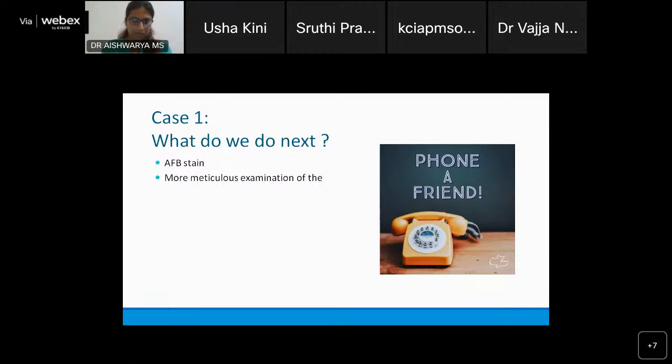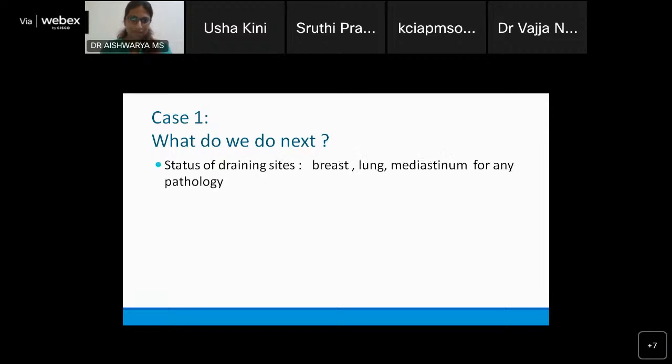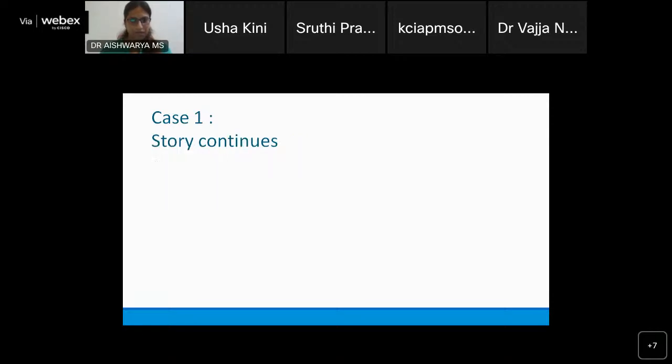I would say phone a friend. I acted as your friend, but I'll tell you more details. It's a lymph node, so you have to look at the areas which are drained. You should ask me, how is the breast in this lady? How is the lung or the mediastinum for any pathology? Anything to do with the axilla, look at the area that it's going to drain, and of course ACE levels. In this case, ACE levels were normal. But that doesn't deter you from making a diagnosis of sarcoid if that is in your mind, because in early stages you may not get increased levels.